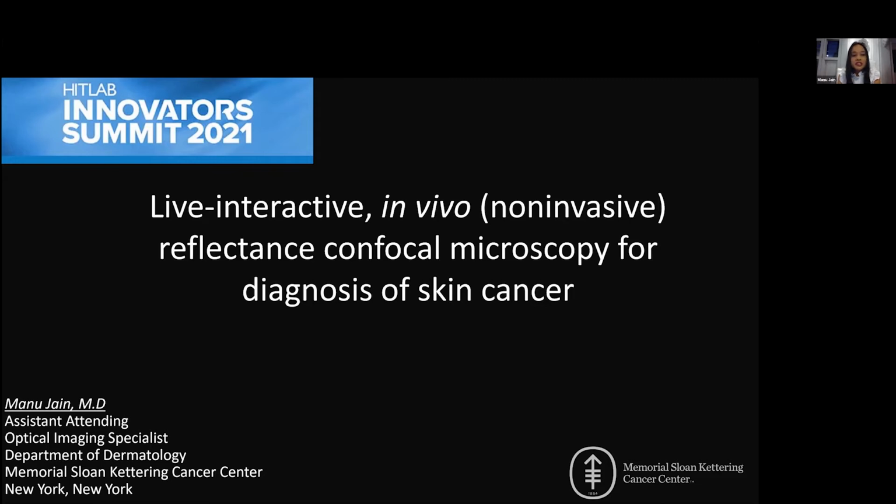My name is Manu Jain, and today I'm going to talk about a live, interactive, in vivo, but remember, non-invasive technique, which is called reflectance confocal microscopy, that we are using for diagnosis of skin cancer.